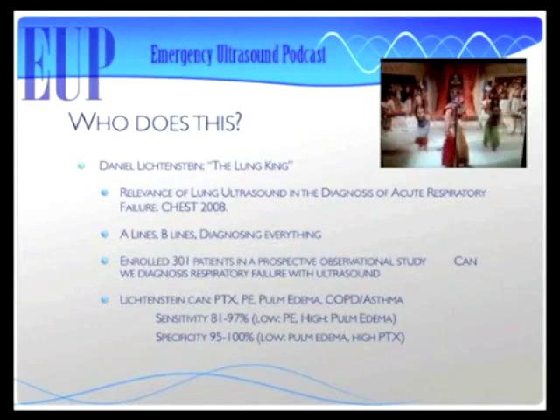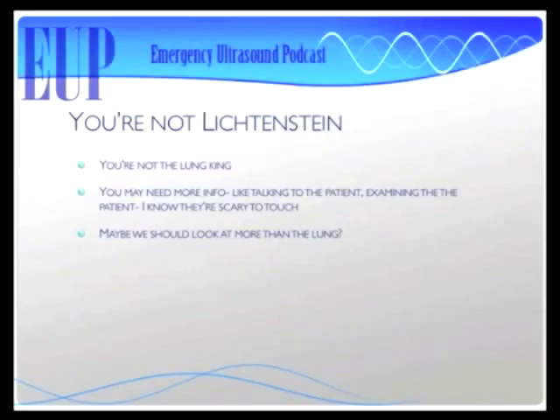So no history. He didn't know these weren't patients that he was taking care of. No, he wasn't attending in the ICU when he was doing this. I think this was all critical care patients. So this was blinded, so he had kept his eyes closed the whole time he was doing this as well? I'm not sure if he kept his eyes closed or not, but in any case, it's pretty impressive. Right there. Yeah, right. He could actually see the patients. Check out the big brain on Brad!